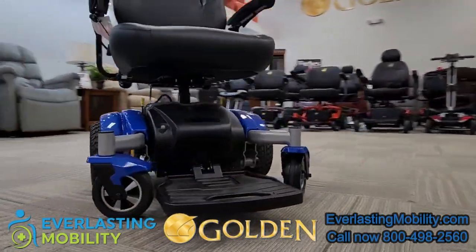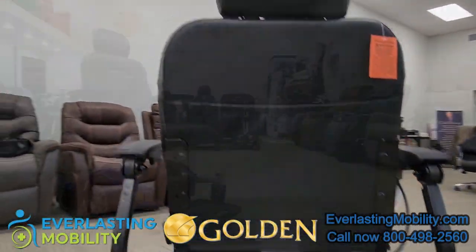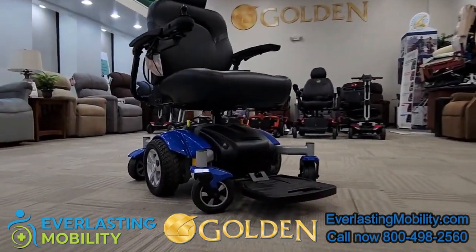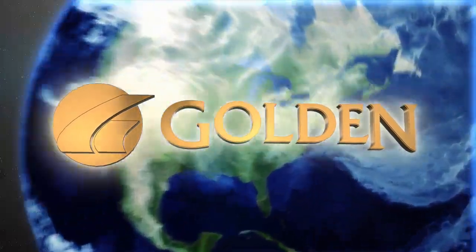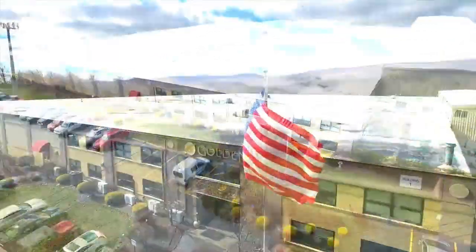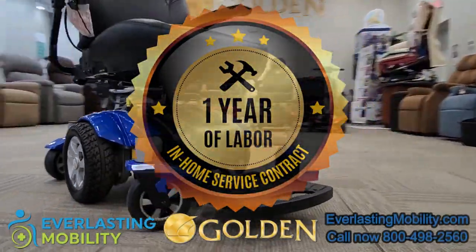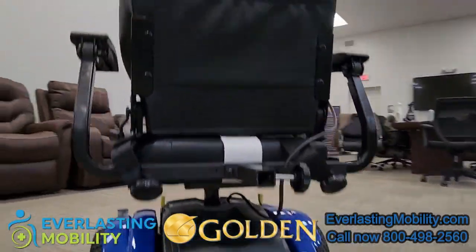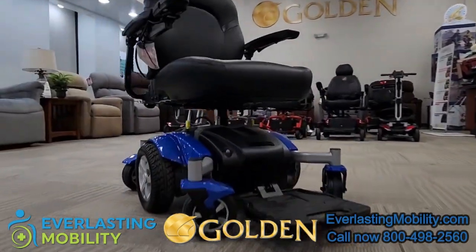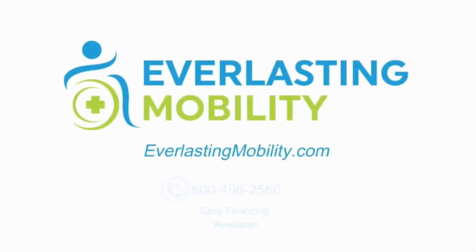In conclusion, if you're looking for a nice, well-made center wheel drive heavy-duty power wheelchair, the Compass HD is an excellent choice. Golden Technologies is one of the best brands in the industry — they've been around for a long time and have one of the best warranties, which includes one year of in-home service. As long as it's an approved claim, they will send a technician to your home to diagnose and resolve the issue within the first year. If you have any questions, please give us a call at 1-800-498-2560 or visit us at EverlastingMobility.com.